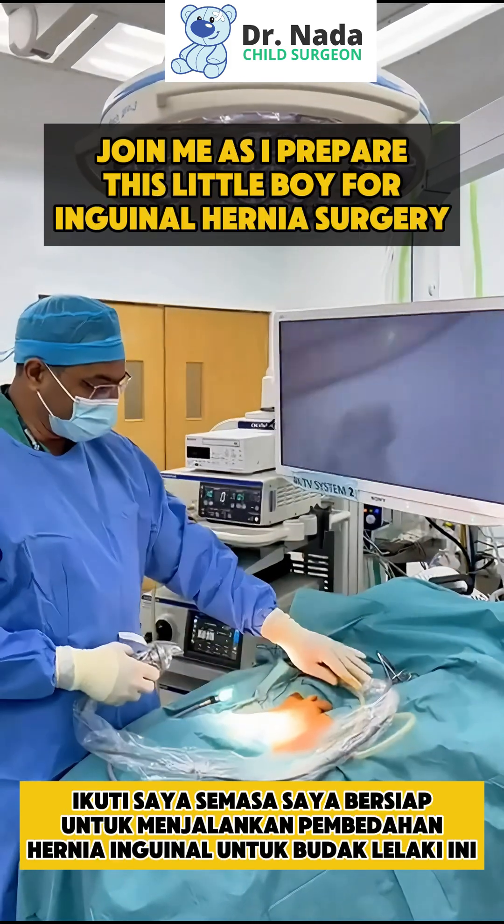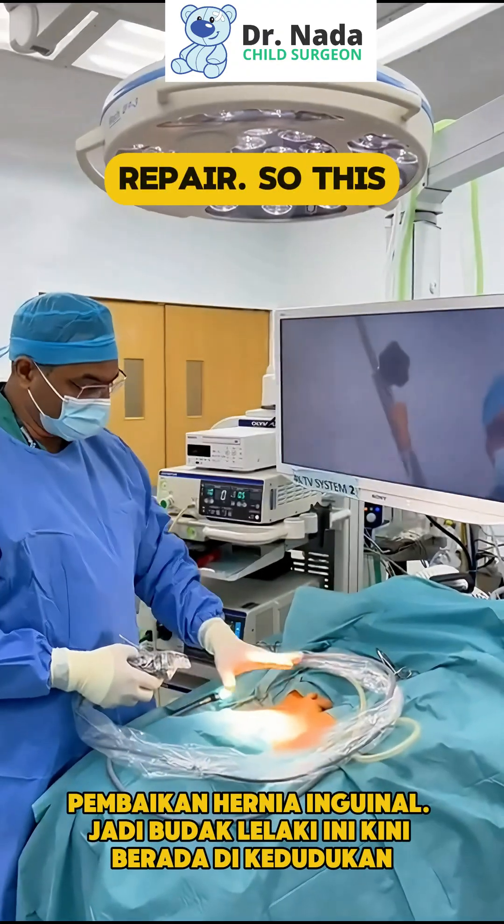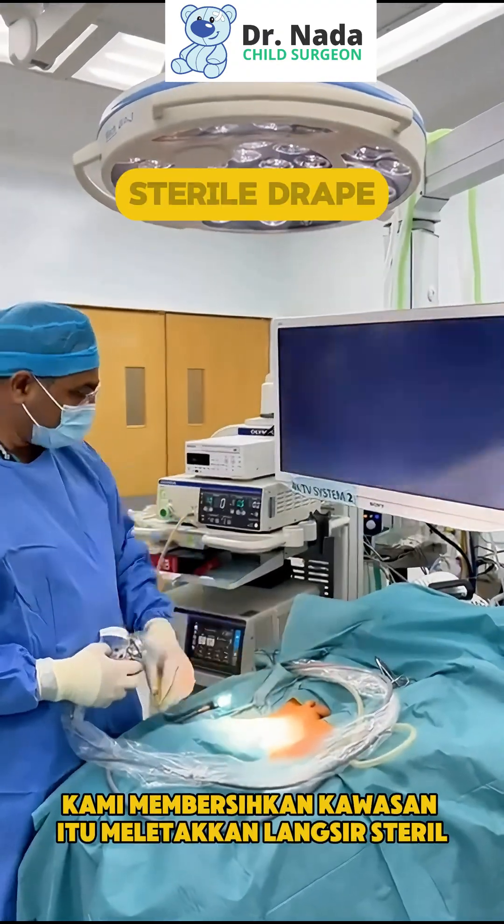Join me as I prepare this little boy for inguinal hernia surgery. This boy is now positioned. We clean the area and put the sterile drape.